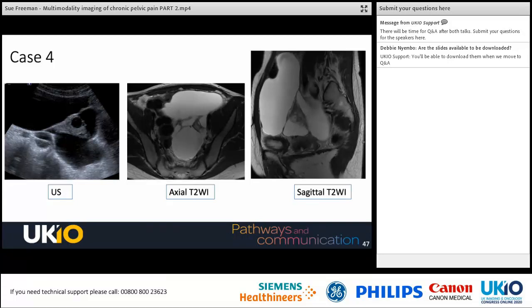But if we look closely, this solid nodule, I think you'll agree, has a rather ovarian shape and possibly even 1 or 2 follicles. Now, this is known as the cobweb sign or suspended ovary. And this is where we can see the ovary is surrounded by fluid and held in place by the ovarian suspensory ligaments. Now, this appearance is pathognomonic of a peritoneal inclusion cyst.